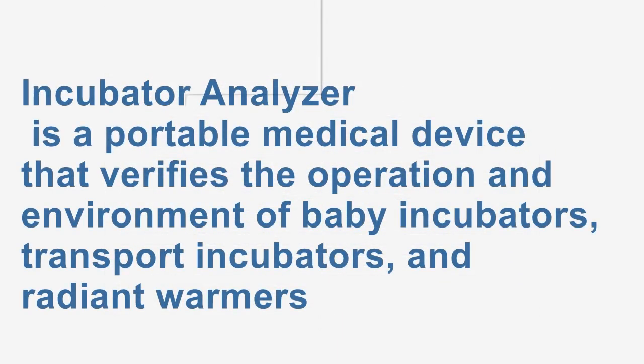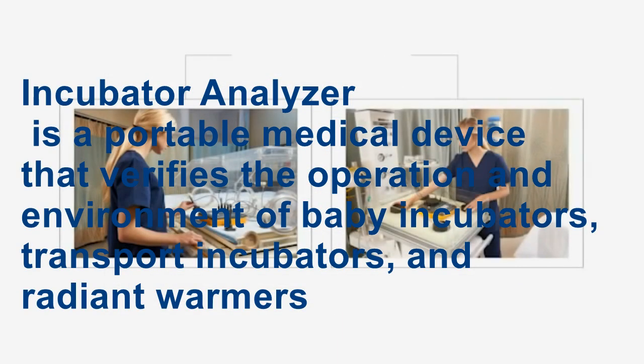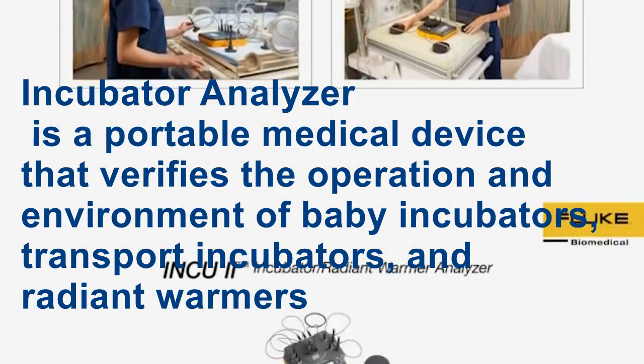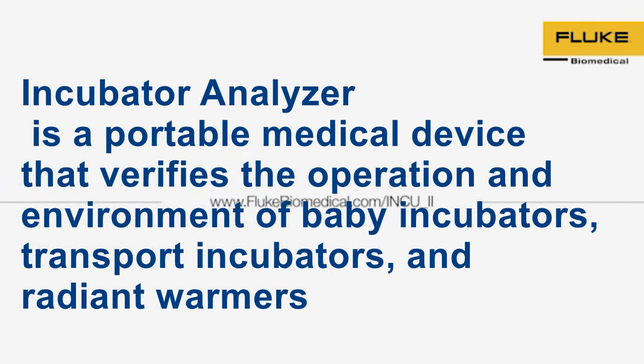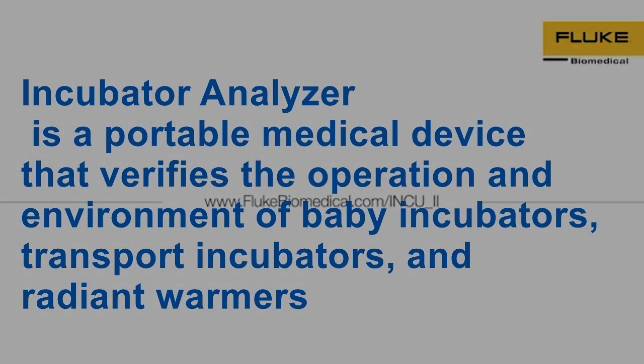An infant's first few days of life can be their most critical. Protect their safety by routinely testing incubators and radiant warmers with the Inq2 Incubator Radiant Warmer Analyzer. Learn more by visiting FlukeBiomedical.com.